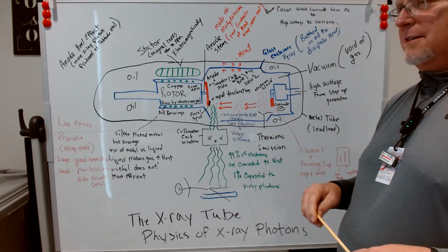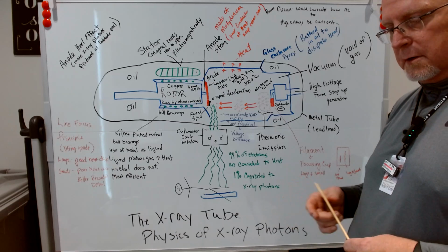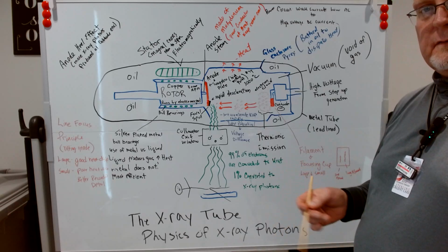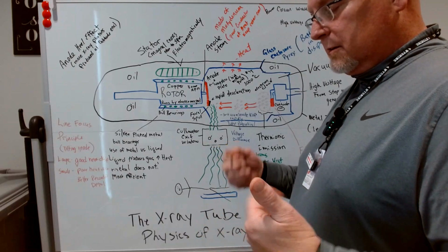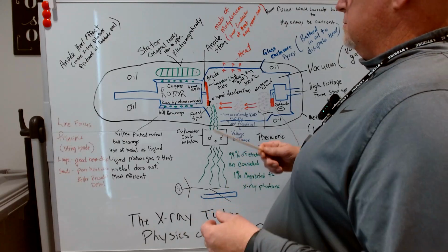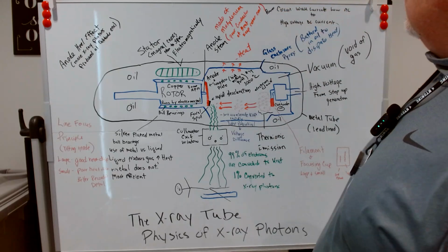You'll also notice that there is a white box in the room on the floor, and it houses a bunch of electrical stuff. Those are actually generators, and generation of electricity is what enables us to take X-rays. Our generators are plugged into the wall.